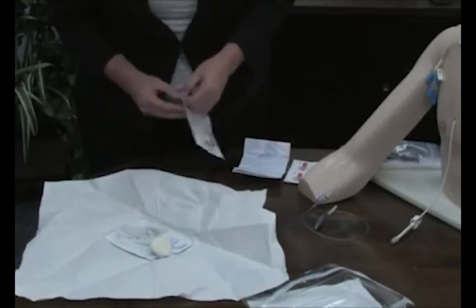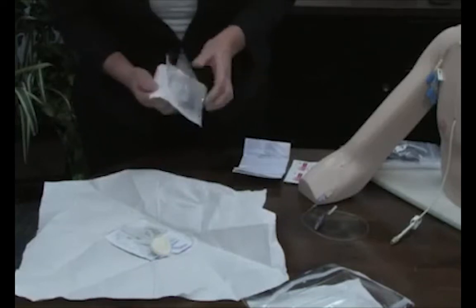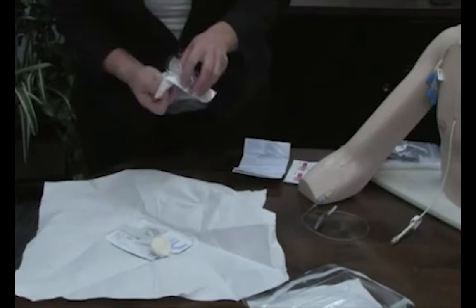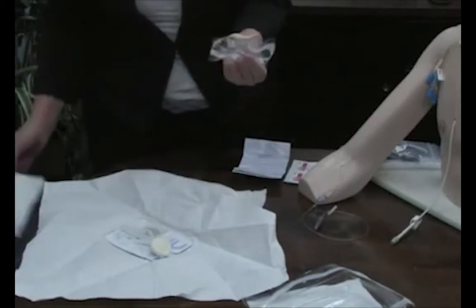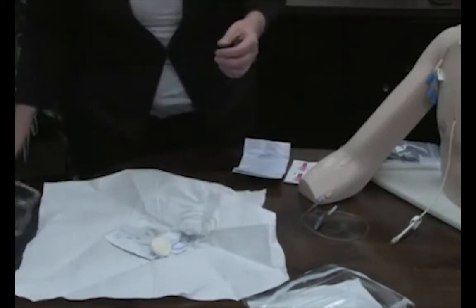When I open up my extension set, I again use a technique that helps keep it from popping out. I grab a hold of the supply and pull off the top and place that in my sterile field.